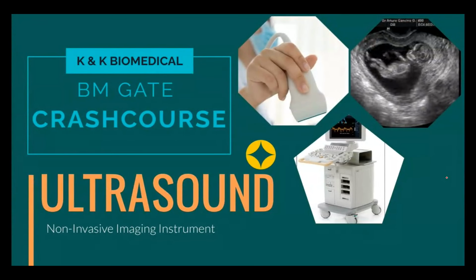In imaging systems, if you take any radiological equipment used to acquire an image of a human, ultrasound plays the major role, because ultrasound acquires non-invasive images from a human body.